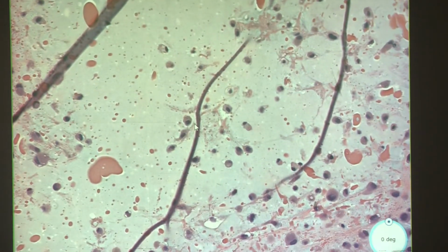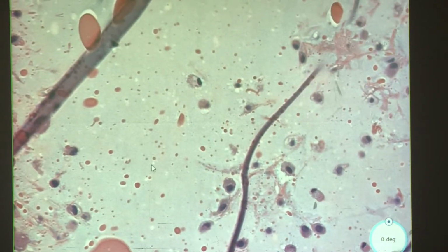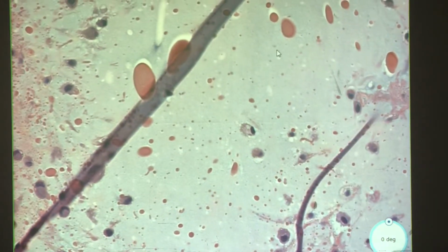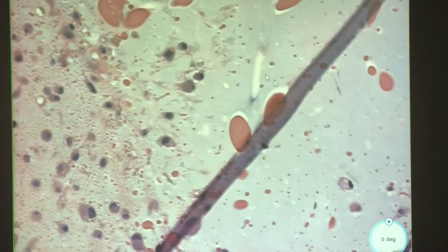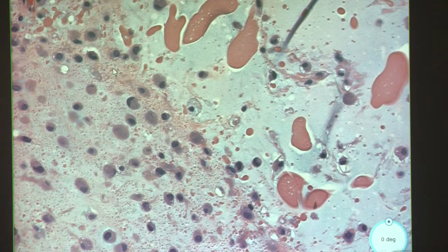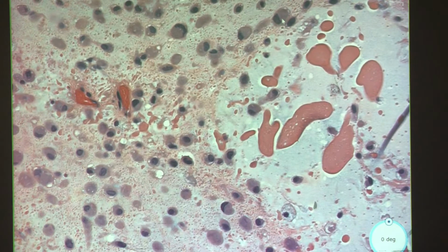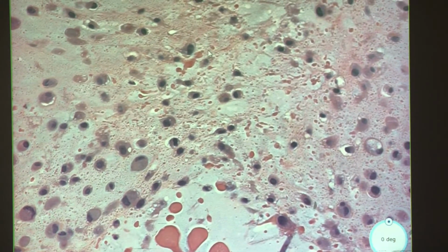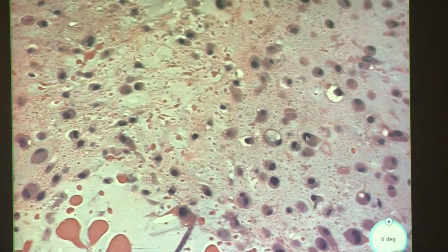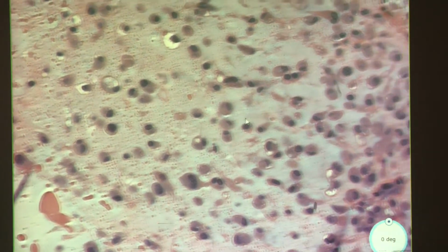Okay. So yes, this is definitely cartilage, because it has that glassy appearance that we see with cartilage, which would make all of these guys chondrocytes. But when we start seeing somewhat irregular nuclei, there's some atypia associated with these chondrocytes, but not a whole heck of a lot.